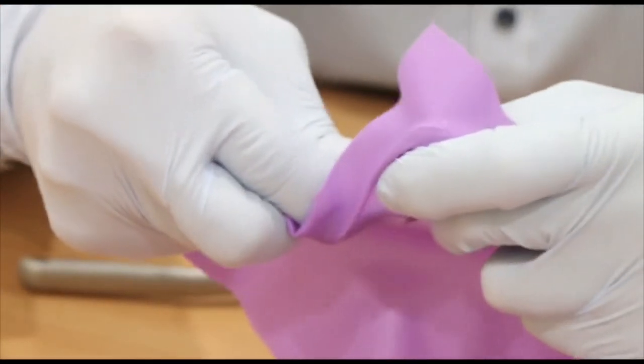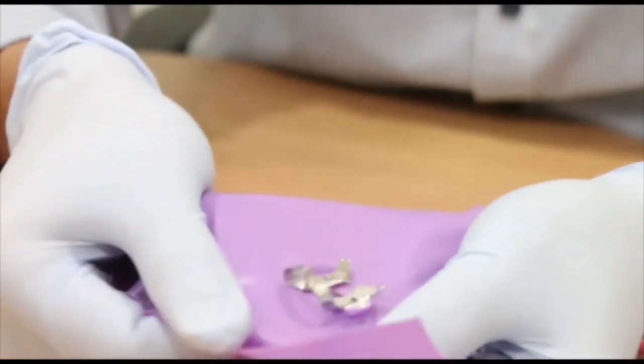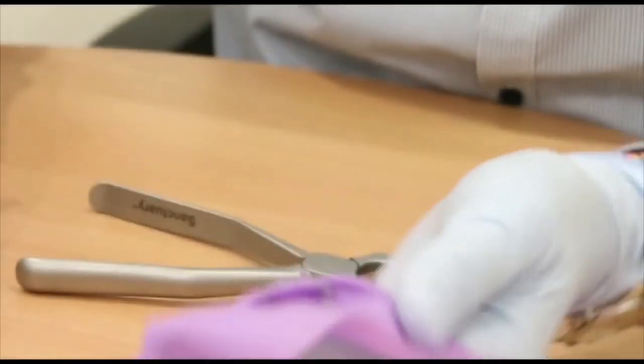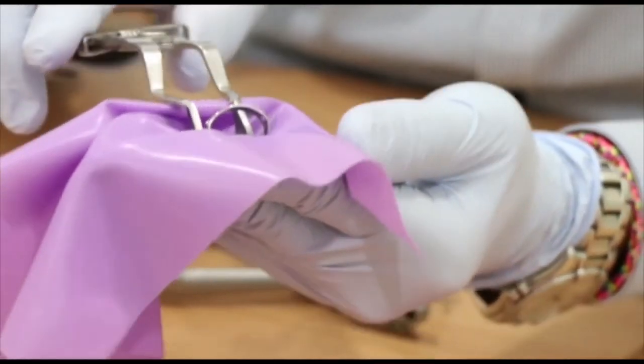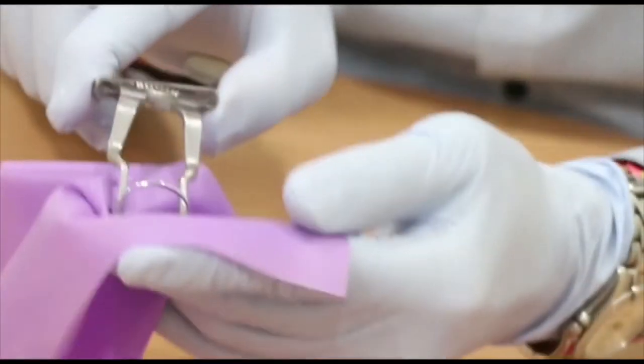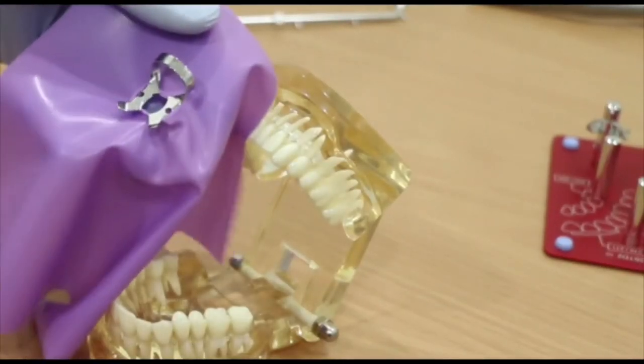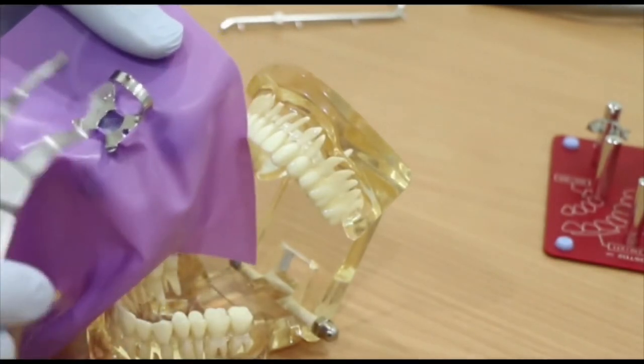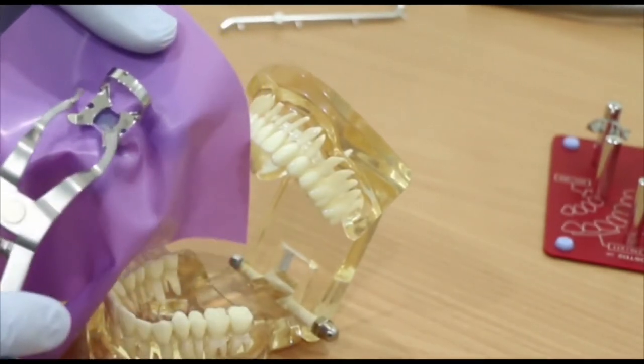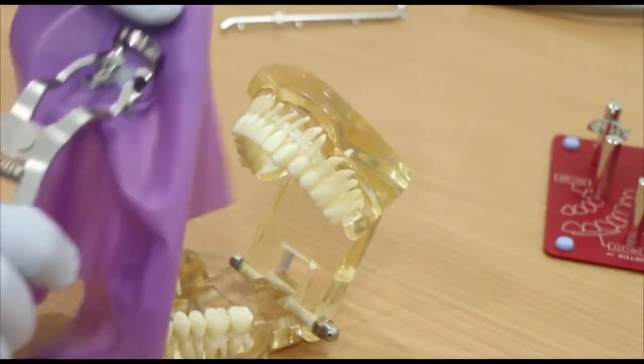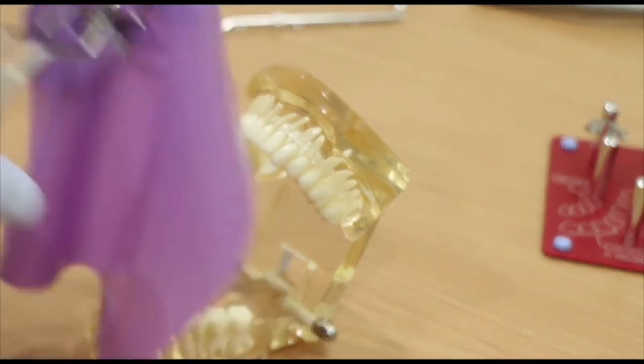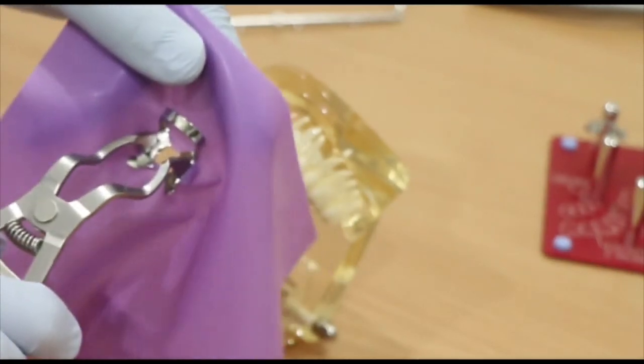So it's very good for easy placement of the rubber dam, and therefore we are going to put this onto the model. As you can see, we have one piece of pre-fixed rubber dam with the clamps, and why is the anti-ripping feature very important?